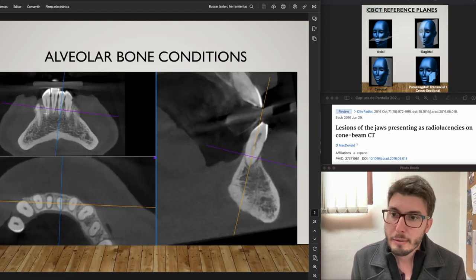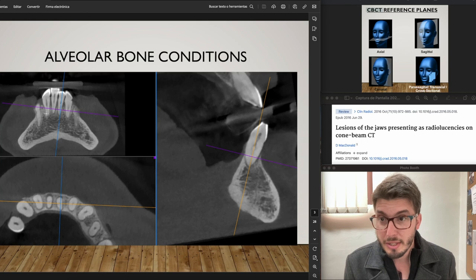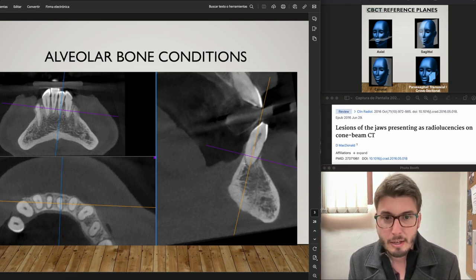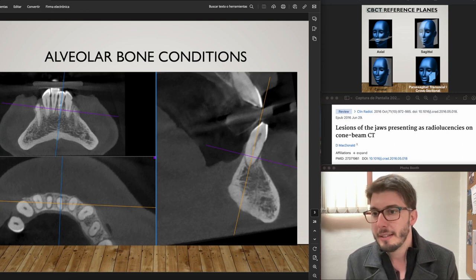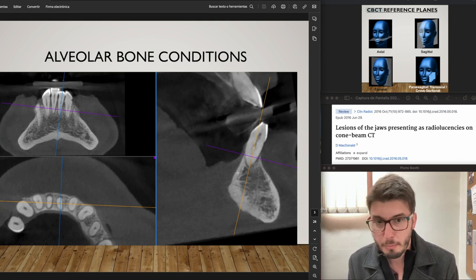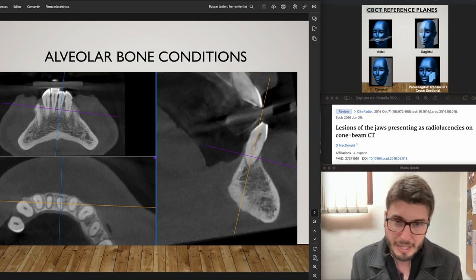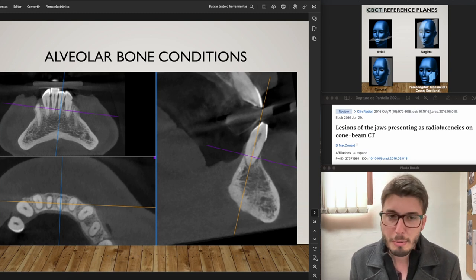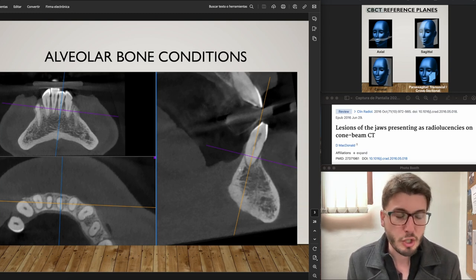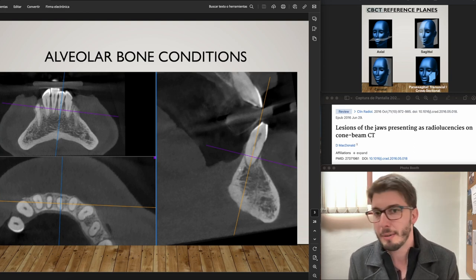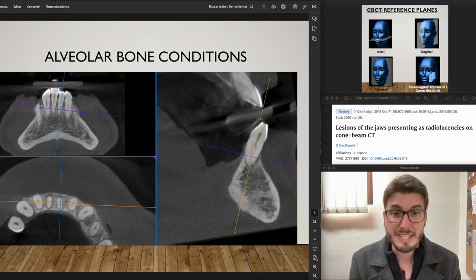To diagnose alveolar bone conditions, you want to tilt the axis of the three orthogonal planes to be parallel or perpendicular to the structures you want to assess. This is still the coronal plane, the axial plane, and the sagittal plane, but now they are tilted. That's the secret with CBCT.